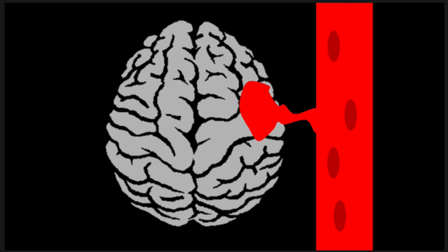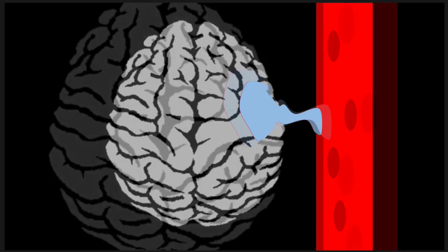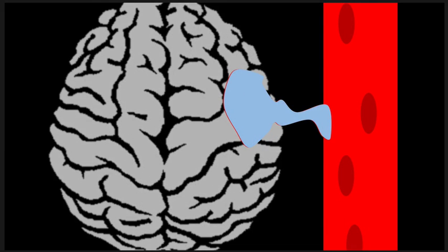And you can think about the structure of the clot at this point. It's probably easiest to think about it as basically just being water. And because it's water, it has signal that's sort of predictable, where it's going to be a little bit T2 bright, and a little bit on the darker end for T1, maybe ISO.